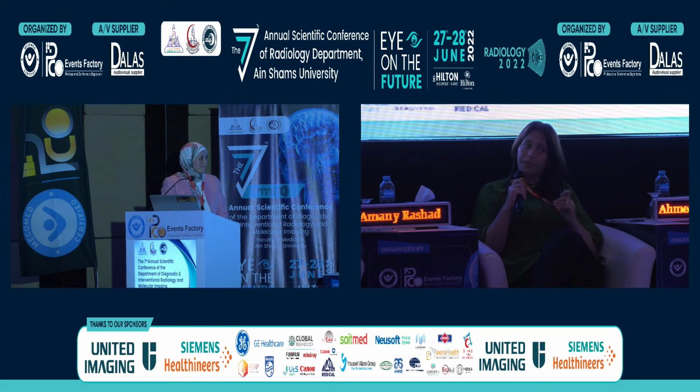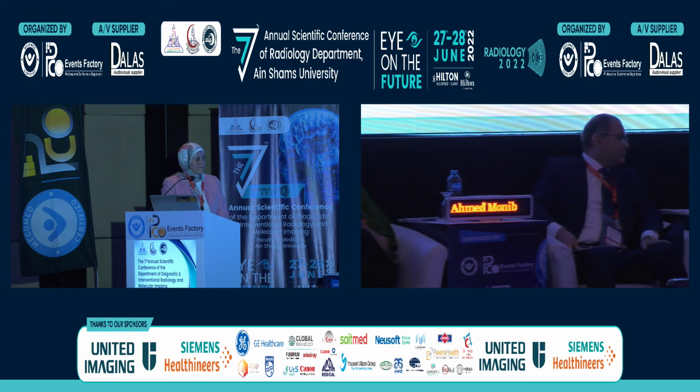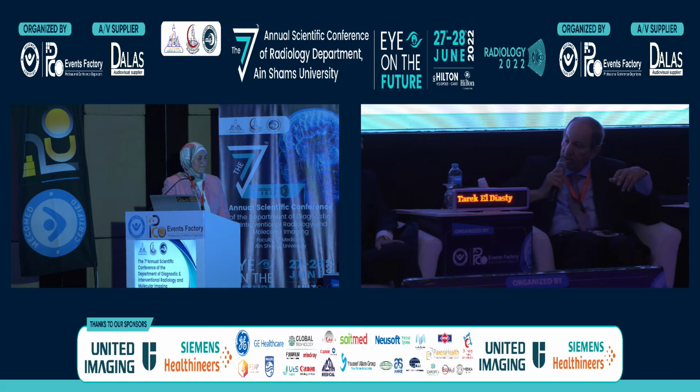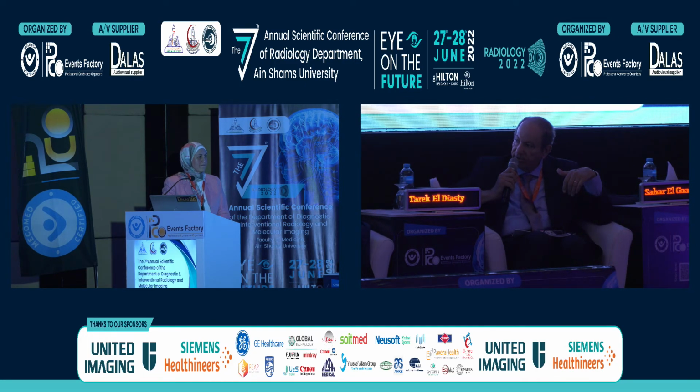But I have a comment. Nowadays, it's proved that MRI is far superior over CT in staging of bladder tumor. So CT shouldn't be requested for the T staging of bladder tumor. Yes, maybe if there is advanced tumor and we look for distant metastasis, we may do CT, but for tumor staging, it's only MRI. So they should start with MRI, and then when they need to look further for very distant metastasis, then they do the CT.